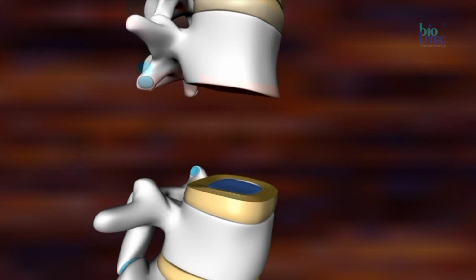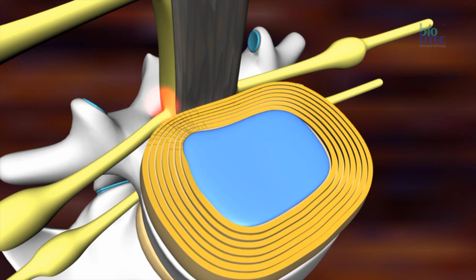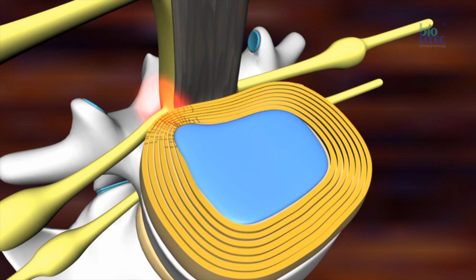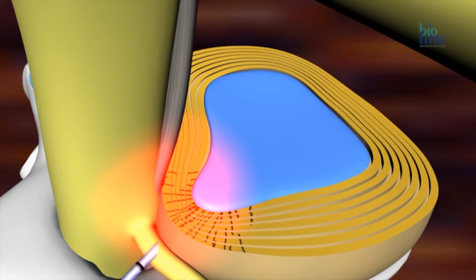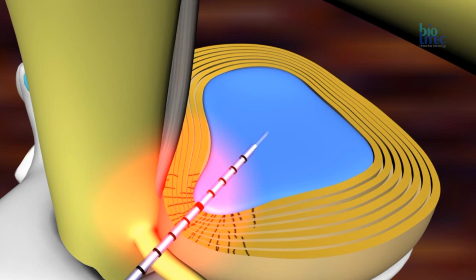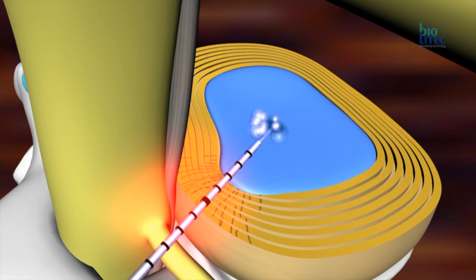The indications for PLDD are contained disc herniations with consecutive foraminal stenosis causing sciatica in patients with failure of conservative treatment. Also, patients with low back pain originating from a damaged vertebral disc, especially a ruptured annulus fibrosus, benefit because of a thermal ablation of the ingrowing nerves into the nucleus pulposus. The post-nucleotomy syndromes are also very treatable.